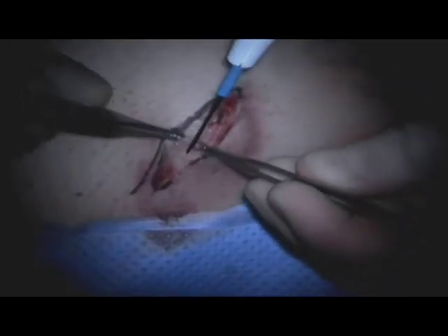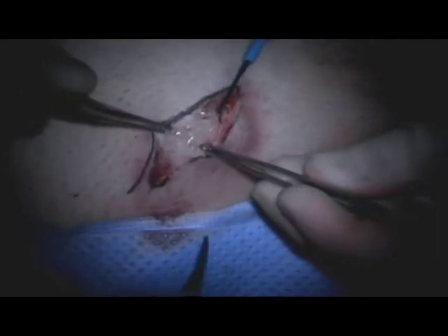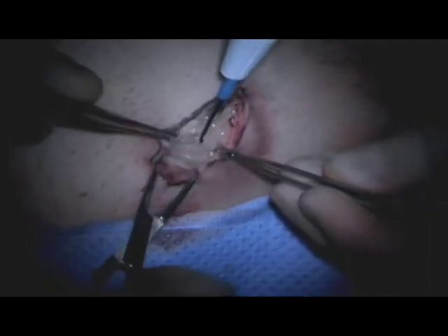After making our incision sharply, electric cautery is used to dissect through the subcutaneous fat layers as well as Scarpa's fascia. As you can see, there is a significant amount of fibrotic tissue requiring slow and meticulous dissection to avoid inadvertently damaging the spermatic cord.